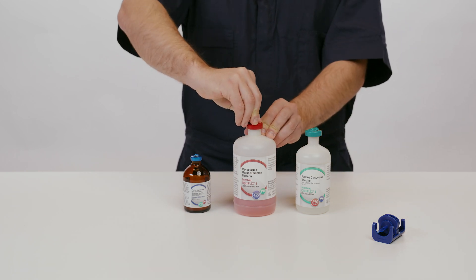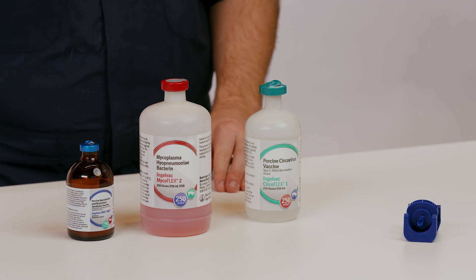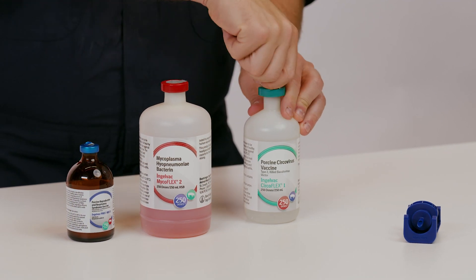Next, remove the red tab from the IngleVac MycoFlex bottle and the green tab from the IngleVac CircoFlex bottle to expose the rubber stoppers.